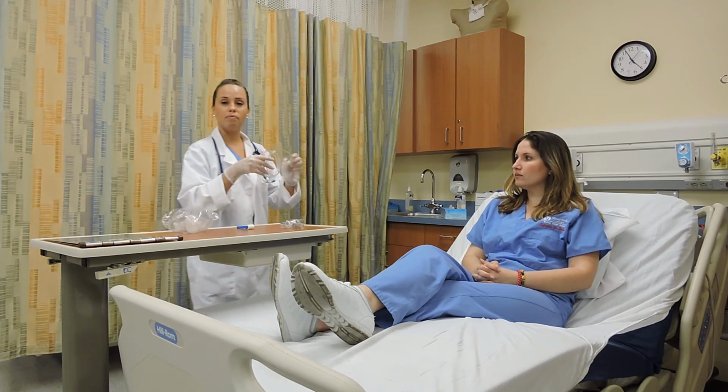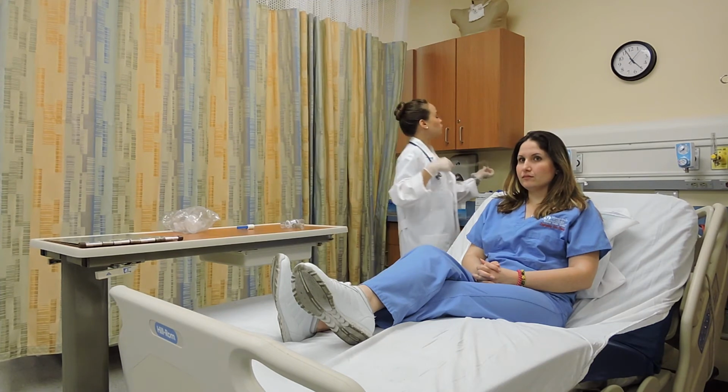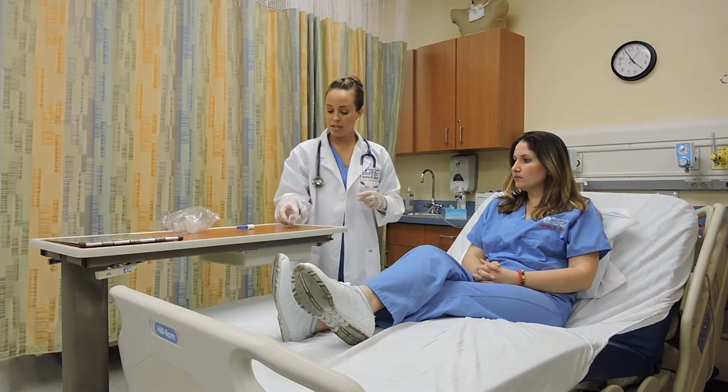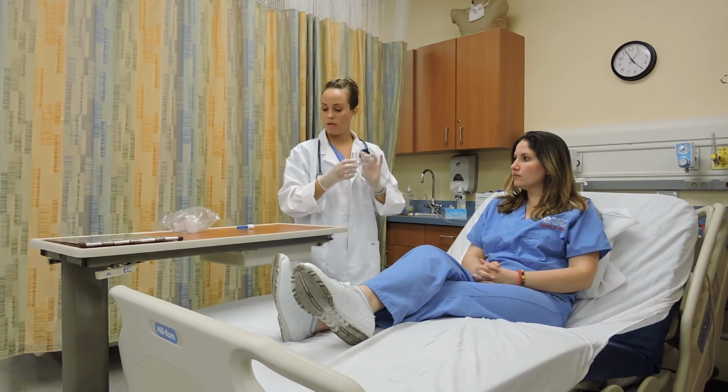I'm gonna go ahead and connect my oxygen tubing to the flow meter. It can be either oxygen or air, it doesn't matter. And the other end, I'm gonna go ahead and attach it to the equipment. Okay?